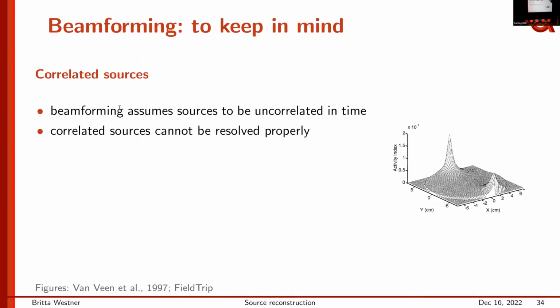And there it really depends on which algorithm you use and what kind of data you have. On the extreme, we have beamforming of EEG data. You can't get away with a spherical model. That doesn't work. You need to have this more realistic 3-layer model for that. So also there you have like a continuum of what is necessary to get a plausible solution of your source reconstruction. That depends on different factors.